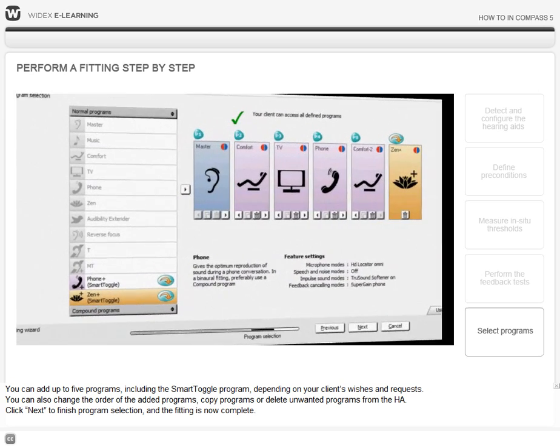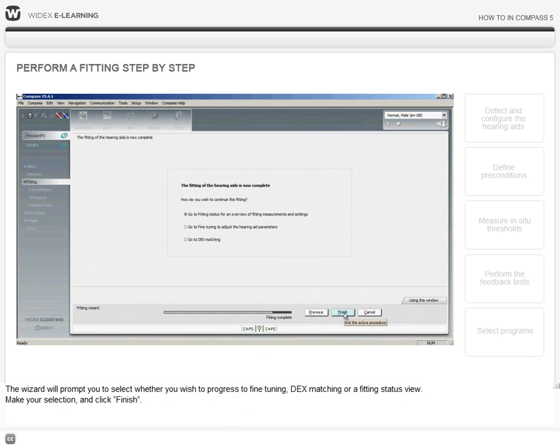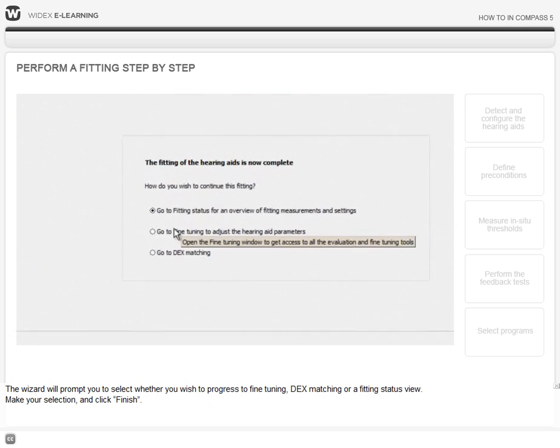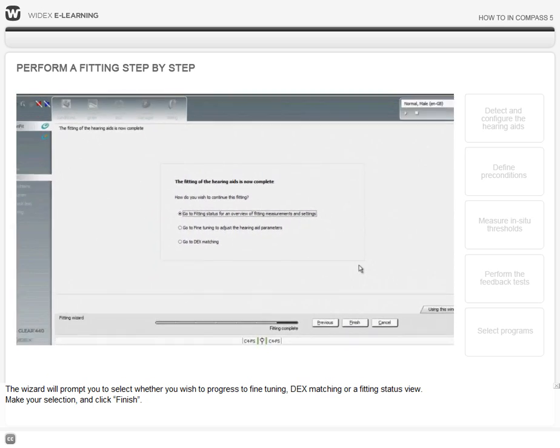Click Next to finish program selection and the fitting is now complete. The wizard will prompt you to select whether you wish to progress to fine-tuning, DEX matching, or a fitting status view. Make your selection and click Finish.